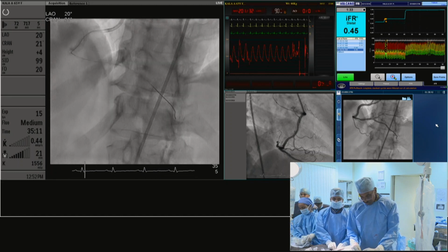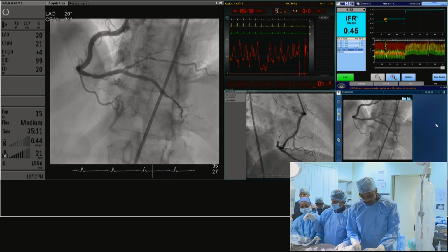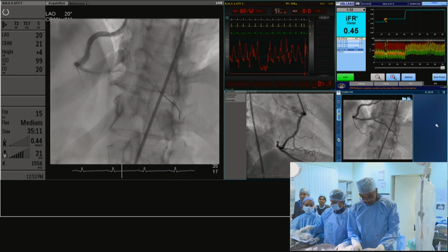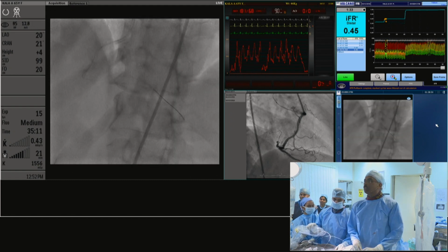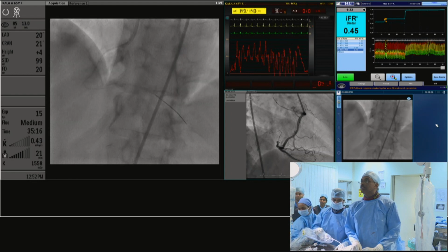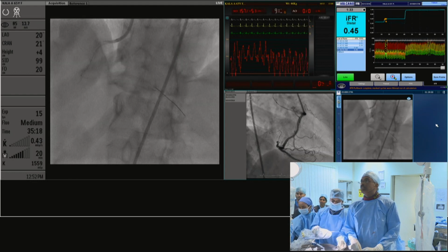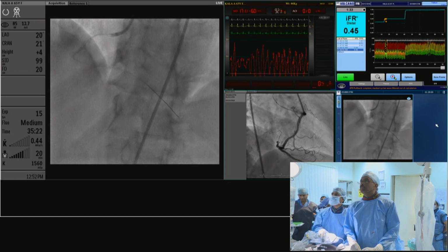The moment we believe that we need to dilate a lesion for the sake of getting devices across, then we are committed to stenting it. If it is a straightforward lesion, fine. But if we have an ugly lesion which has bad outcomes in the long term, it might be prudent, knowing that IFR was negative, to have left it and done it otherwise. That's what I would say.